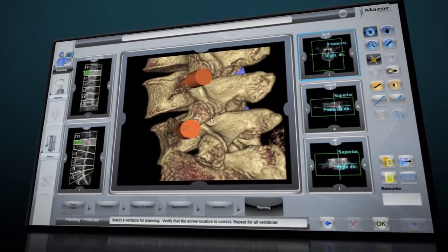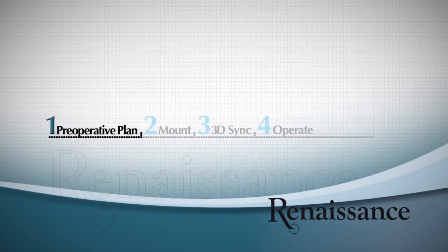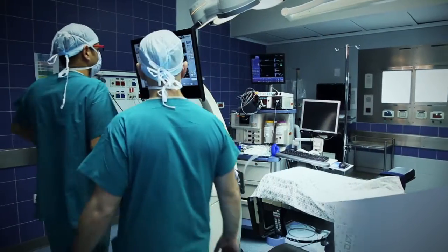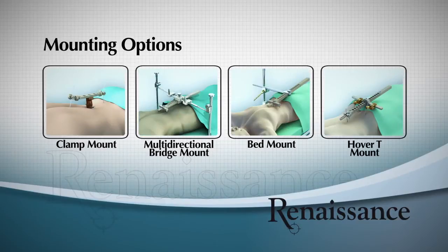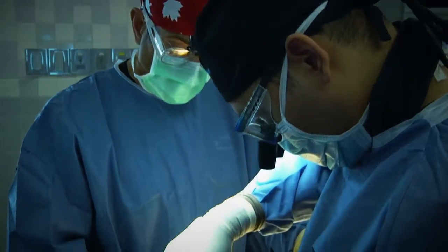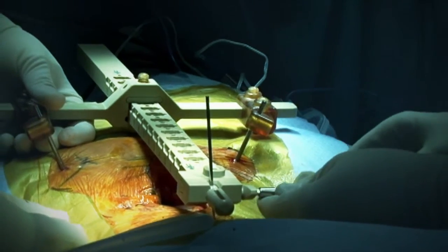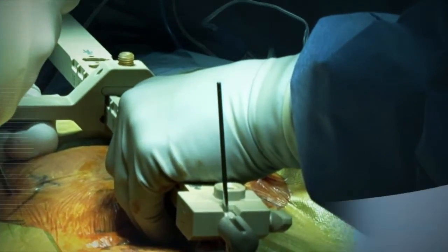Now let's see how we accurately execute the preoperative surgical blueprint with Renaissance in the operating room. The preoperative surgical blueprint is uploaded to Renaissance. Then you select one of Mazor Robotics mounting options depending on the clinical indication as well as your preference. All mounting platforms are rigidly attached to the patient's spine to assure that maximum accuracy is maintained throughout the surgical procedure, even if patient movement occurs.